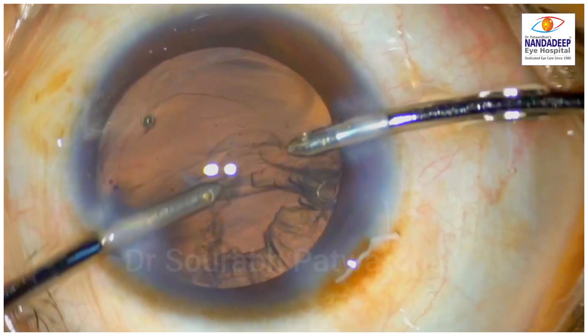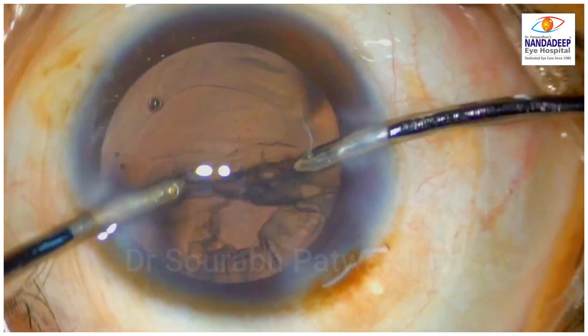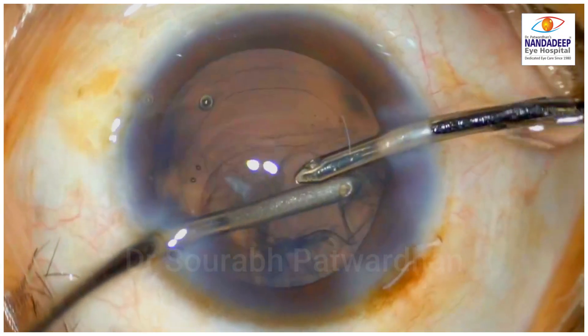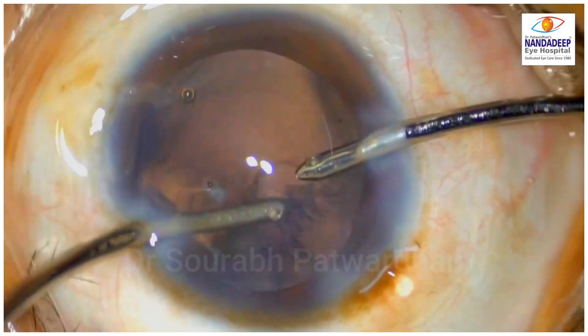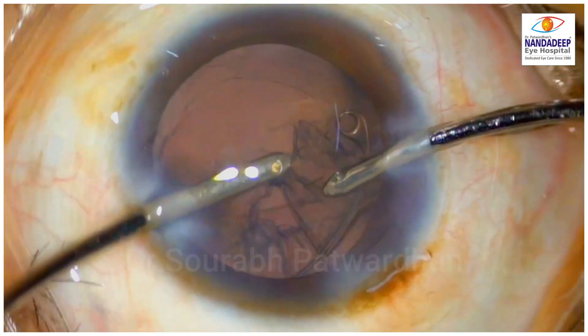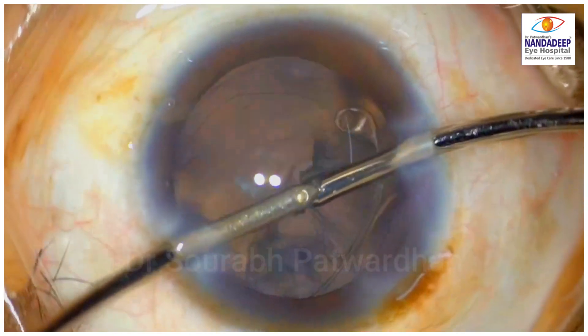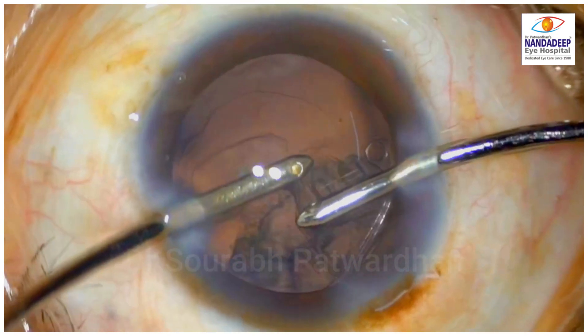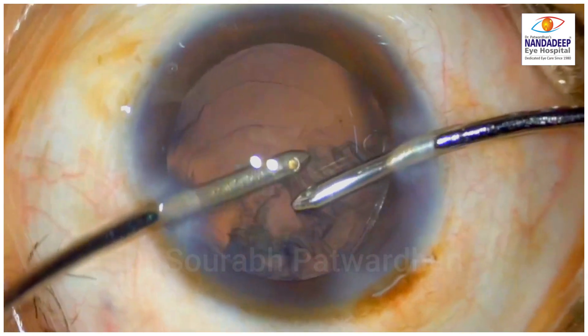As the surgeon tried to remove this cortex, you can see that the CTR is trapping this cortex and not allowing it to come out. The surgeon was a little worried about the movement of the CTR and whether the dialysis will increase or the bag will become more unstable by these maneuvers.